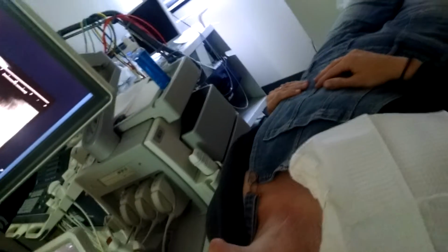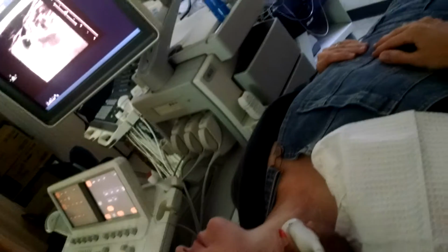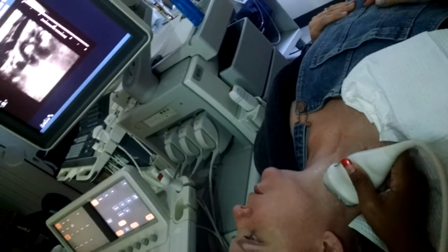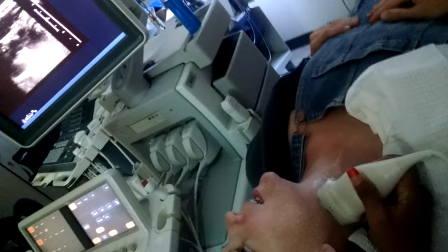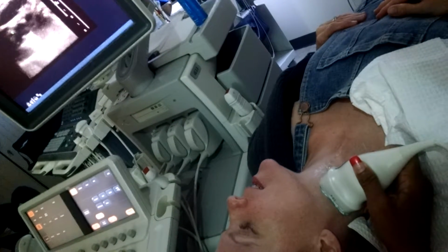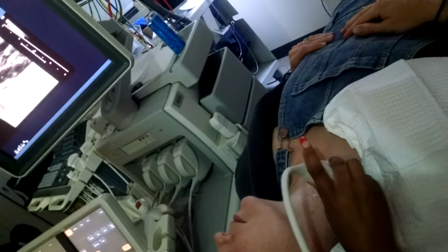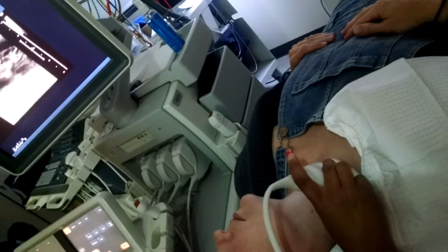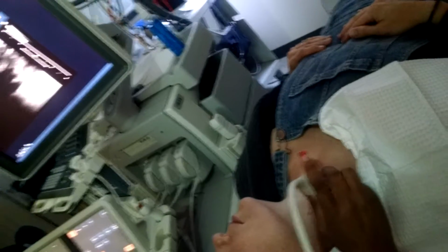So when you start the sweep, do you want to see where the subclavian branches in that image, or do I just go all the way to the clavicle? Everybody will be different. You may or may not see it. Your most proximal portion of your common is at the origin, and that's going to be down by the clavicle. Some people you may see subclavian, some people you may not.